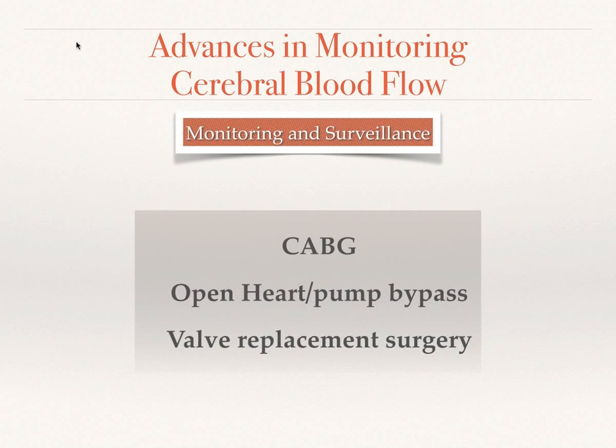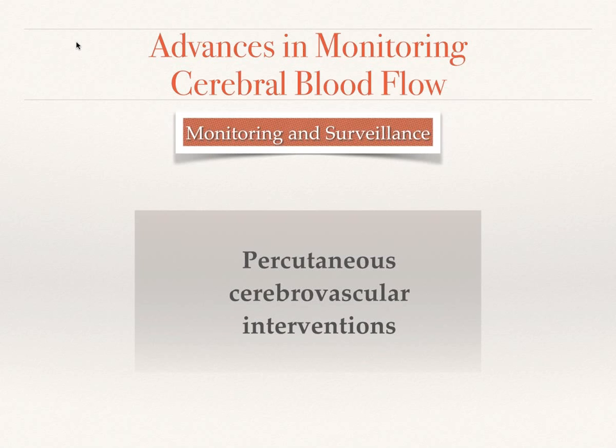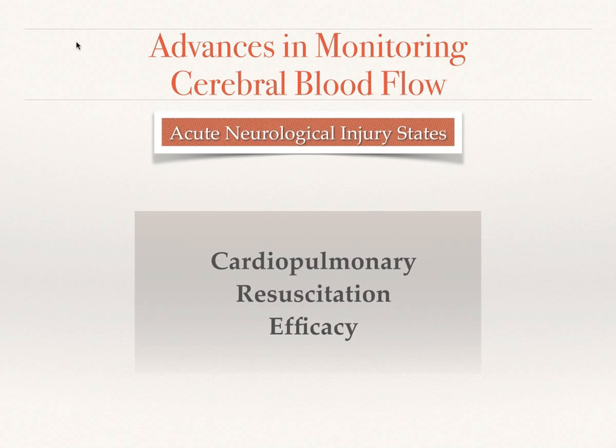Cerebral edema and its consequences, and coronary artery bypass grafting. This may also include open heart and on-pump bypass, valve replacement surgery. These are all conditions that may benefit from a better understanding of cerebral blood flow. Carotid endarterectomy as well may be very well open and ripe, and we've had some very favorable clinical data in this realm. Percutaneous cerebral vascular interventions also appear to benefit from cerebral blood flow monitoring.